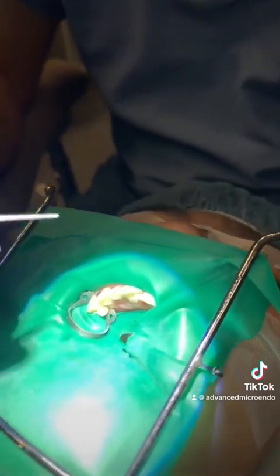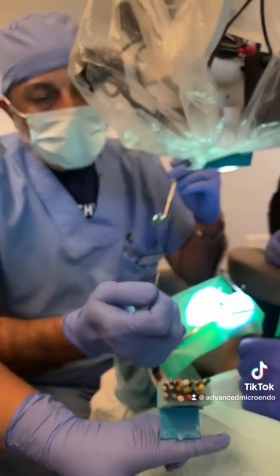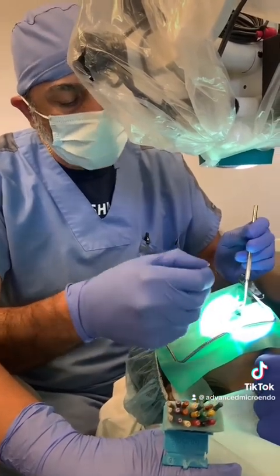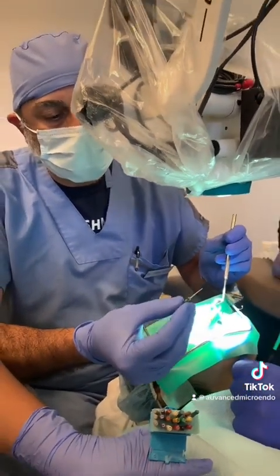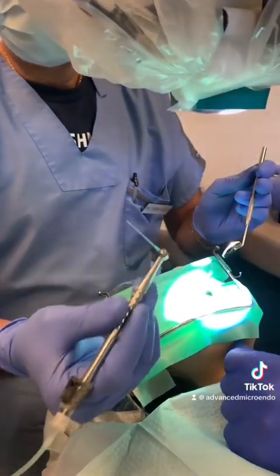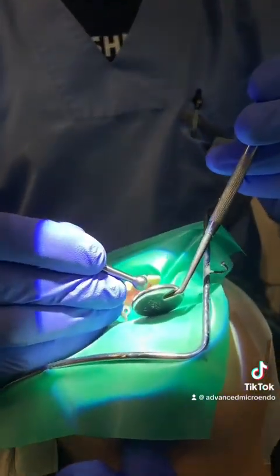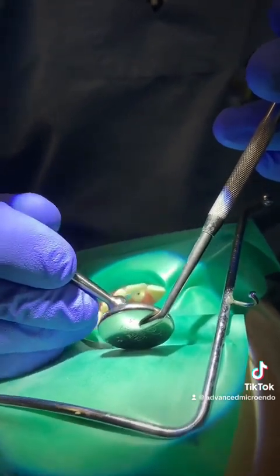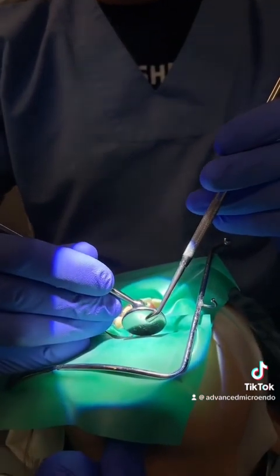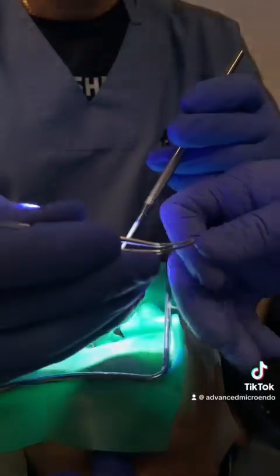Excellent. So now I'm going to use the 70 file to condense the MTA. I mean, you can't really condense the MTA, but I'm using the word. I'm going to push the MTA to where it's supposed to go. Micro suction to get rid of the hypo, and then we're going to dry the canal with sterile paper points. Excellent, very good, thank you.